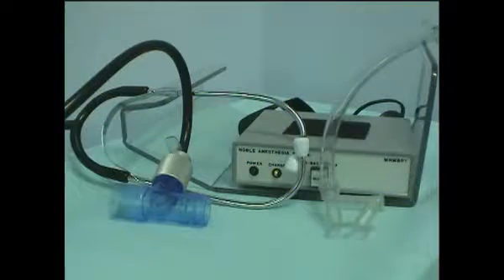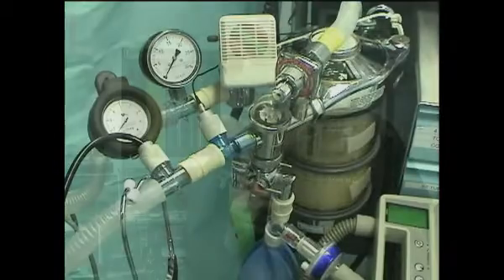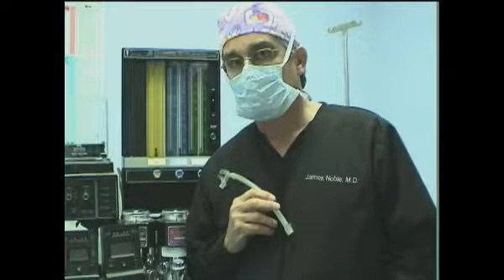airway obstruction. This system of devices for administering and monitoring nasal CPAP is added to standard anesthesia and CPAP systems to provide practical alternative solutions to common airway management problems. An experienced anesthesiologist will recognize those areas in his own practice where there is room for improvement.